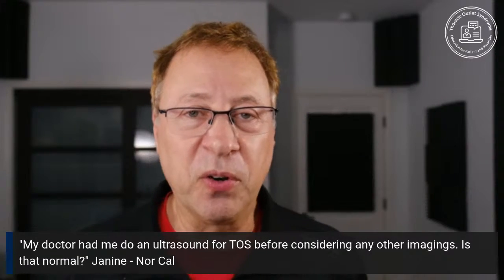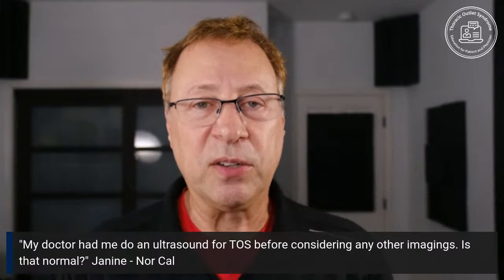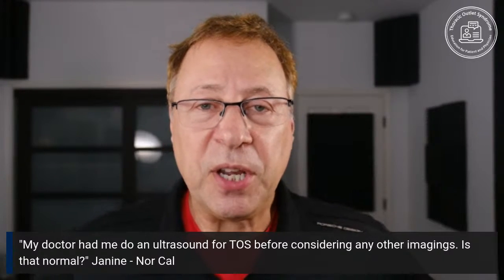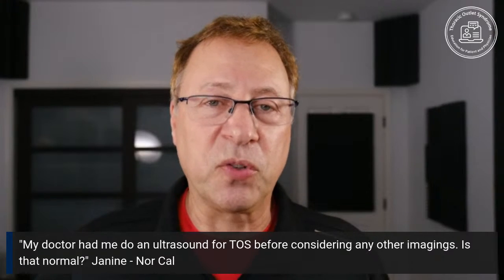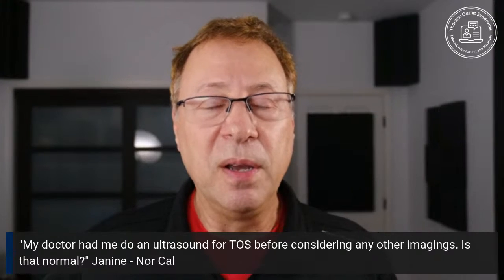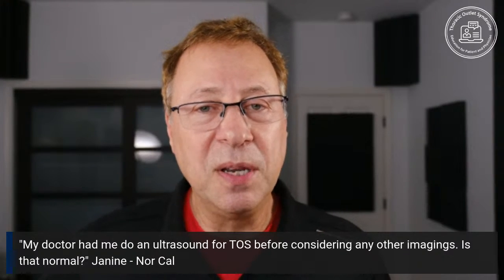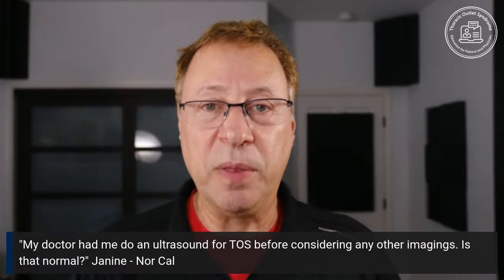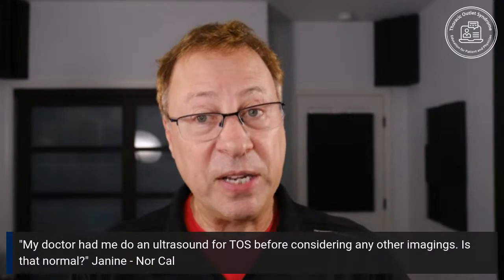I know at Stanford, they published a paper a few years ago with a team that said, we do ultrasound on everybody. And when you read the paper that they wrote, they're basically looking at the blood vessels. You may recall when I showed the pictures of ultrasound and blood vessels, I said it works great. You can really see compression, but you can't see whether the brachial plexus is compressed. And this is critical. From my MRI studies, I know there are patients with brachial plexus compression who have no arterial compression, and vice versa.